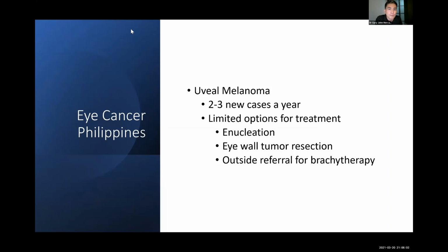Because of the limited options for treatment, most go to enucleation. And if it is possible, I do eye wall resection. Sometimes, in a very few cases where I see the case quite small or early in the disease, I could refer them for outside referral for plaque brachytherapy. However, of course, there are limitations, and you could expect limitations in terms of finances.